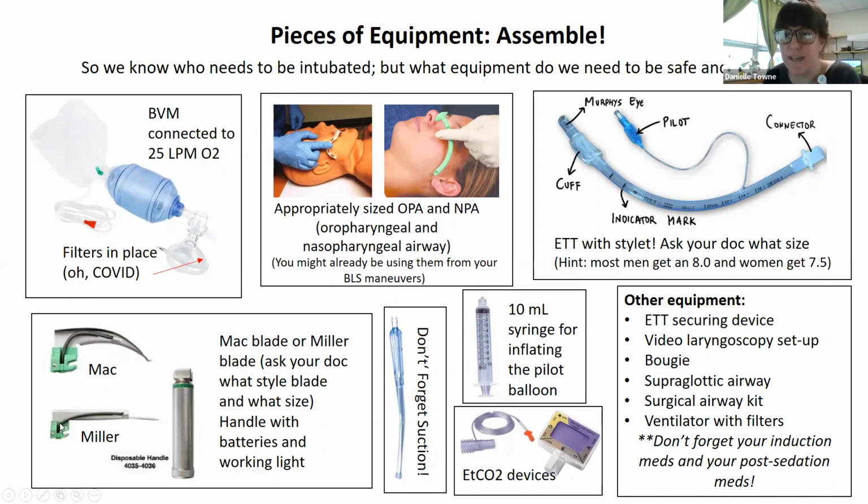And they all have different sizes, and again, it's written on the side of these. So how it's positioned here, if you were to turn it and face it towards you, you would actually see the size written out there. So if you're ever asked anything, that's all you have to do, just hand them that.